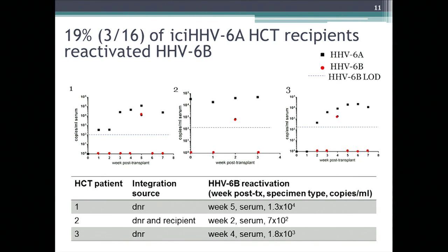And in each of these patients, there was 1 reactivation in a single sample of HHV6B that we could clearly detect with this assay.